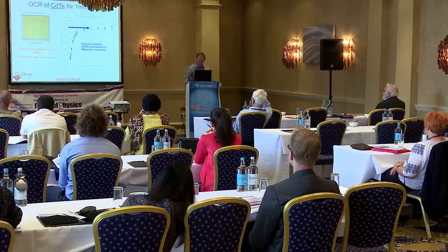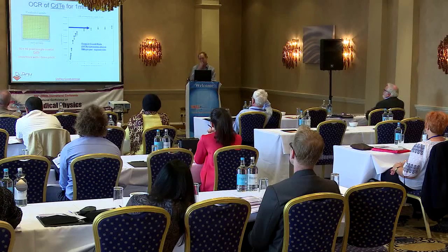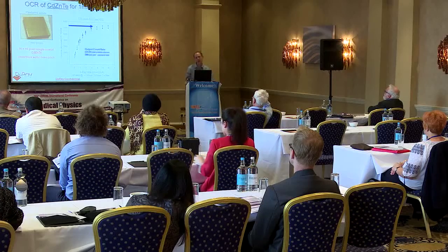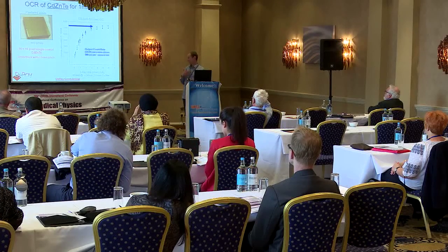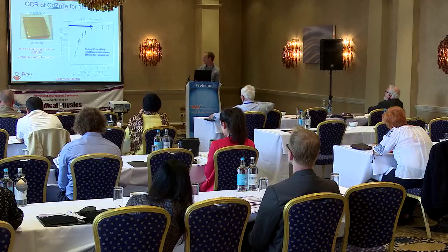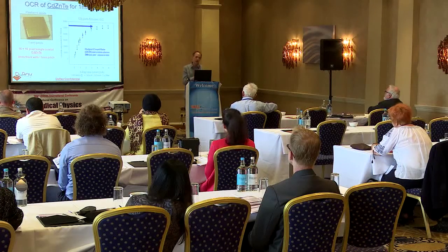And so here's a picture of the cadmium telluride, and it's also important to be able to use cadmium zinc telluride because of the availability of these materials, having only been developed in the last decade or so. There's very few sources. And so cadmium telluride and cadmium zinc telluride can be used.